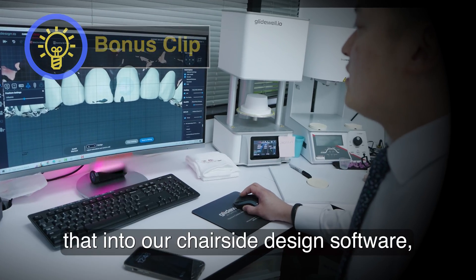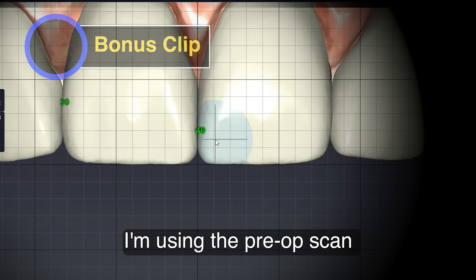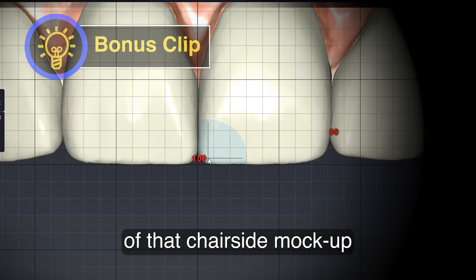And then once we transfer that into our chair-side design software, I'm using the pre-op scan of that chair-side mock-up.